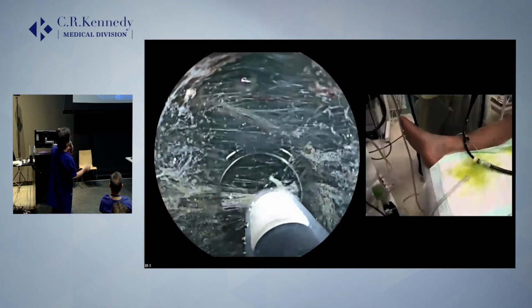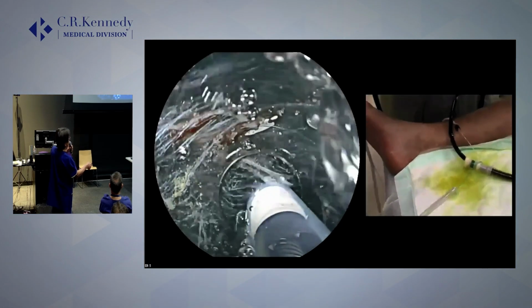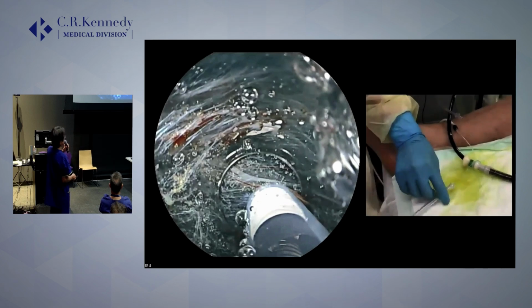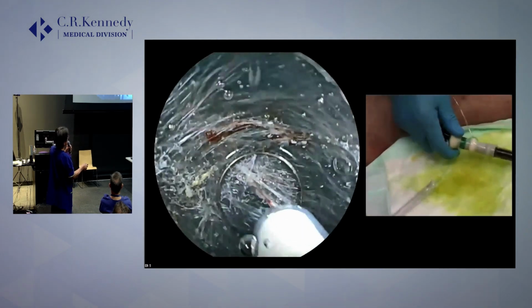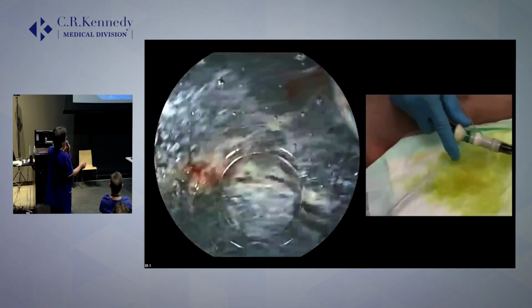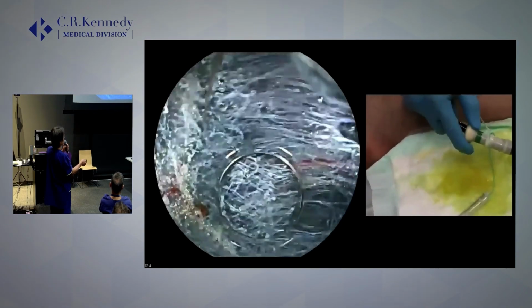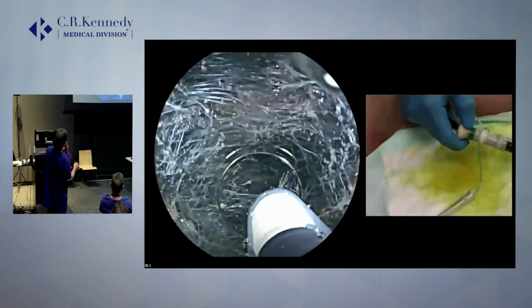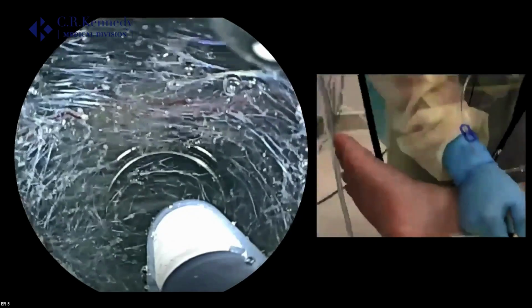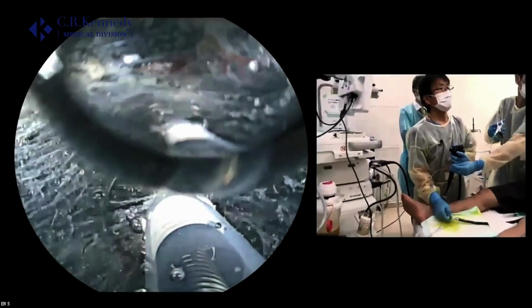So I connected the suction tube to the over tube, like I showed in today's demonstration. So this is the suction. So the saline is sucked away through the over tube. So the infusion is from the knife and drained through the over tube.